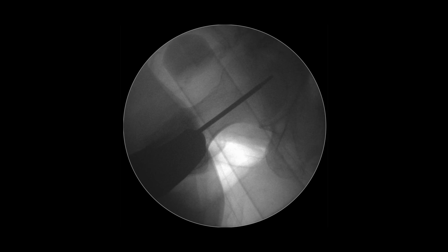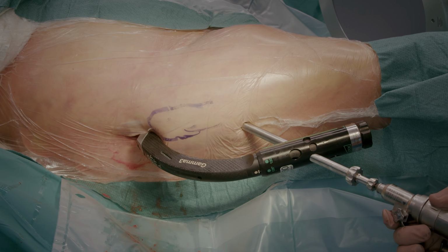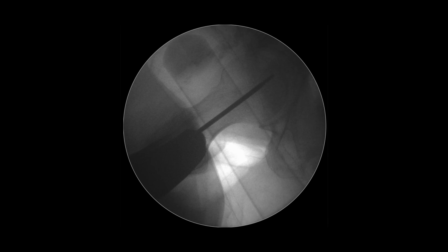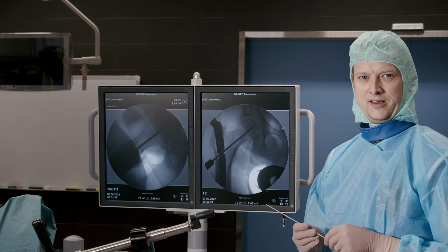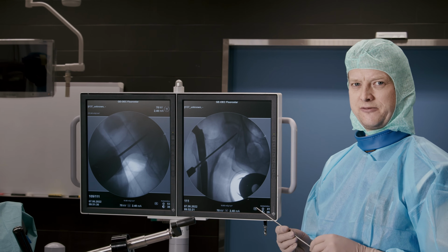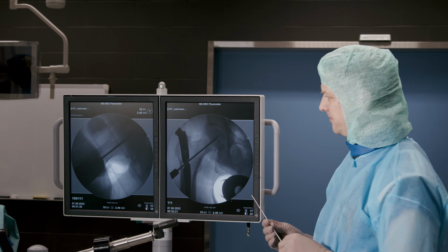We can still go a little further with the guide wire. Let's take a closer look at the guide wire position from this fluoroscopic image.